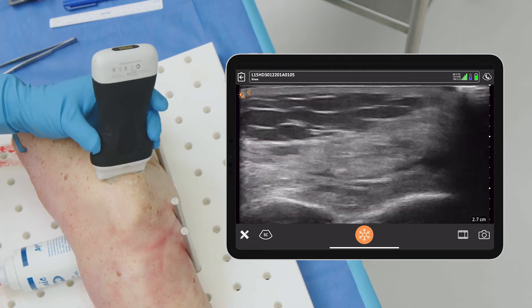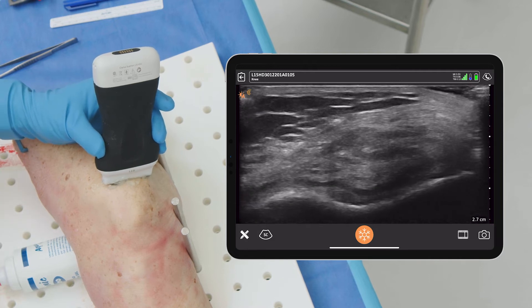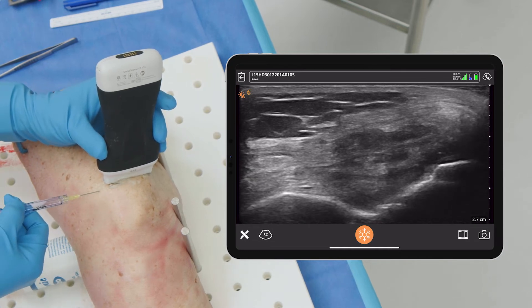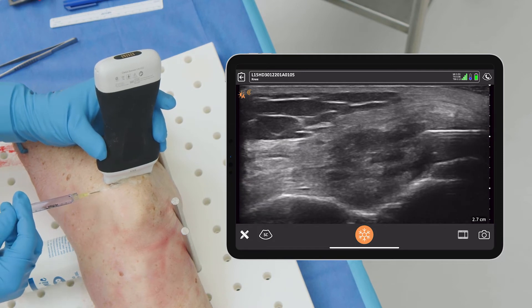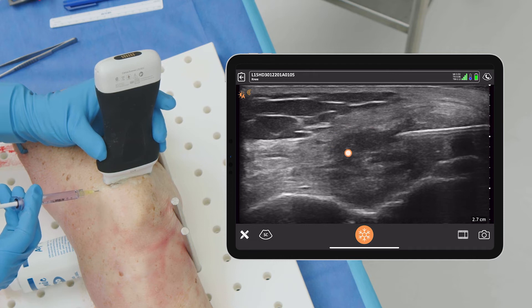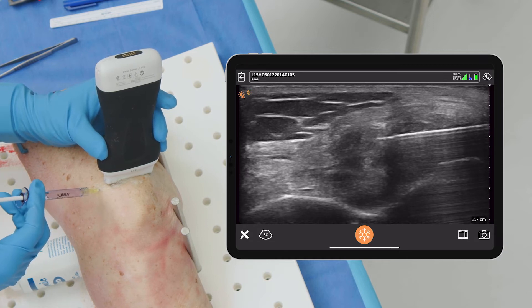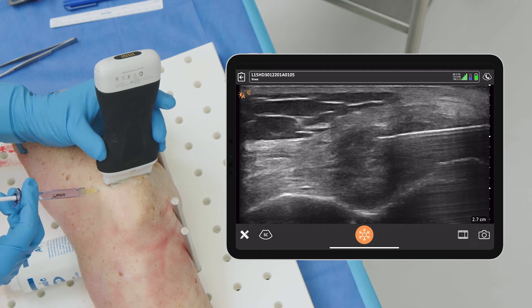But the best way really is to come in kind of short axis, find the area you want to enter into the tendon, and then come in basically in-plane, in-line. Bring in your needle, go directly into the tendon you want to go into. There's a spot that I see — a little bit of a hypoechoic area of the tendon. I can just inject the tendon there, move forward a little bit, come to the tendon there, inject a little bit. You can actually get your biologic introduced to the exact spot you want.